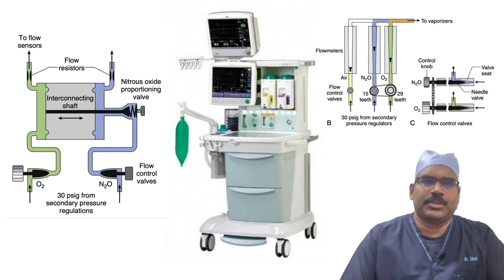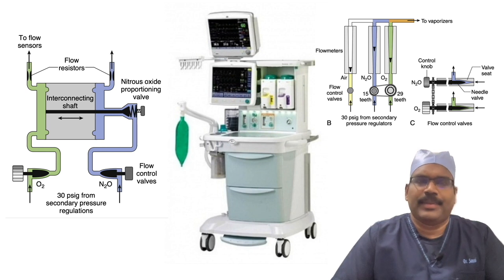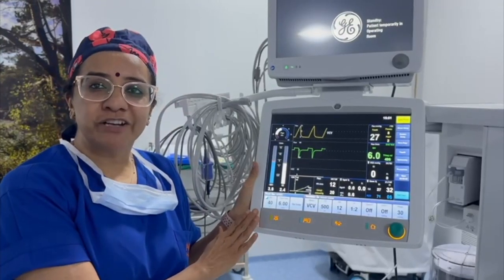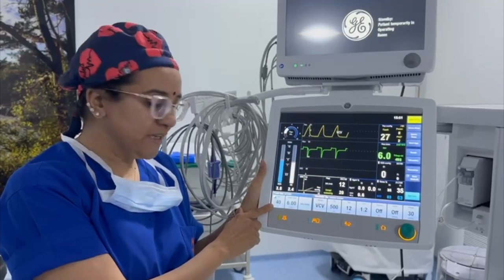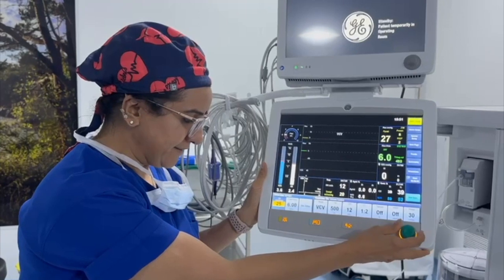Still with Amrita Hospital, Faridabad, 25% oxygen is one of the time-tested anti-hypoxia safety features. Dr. Neeti shows us this feature in GE Advanced CS2. So this is a GE machine where we are using nitrous. Now once I reduce my percentage from 40, you can see that the nitrous also gets decreased and the ratio remains 1:3.